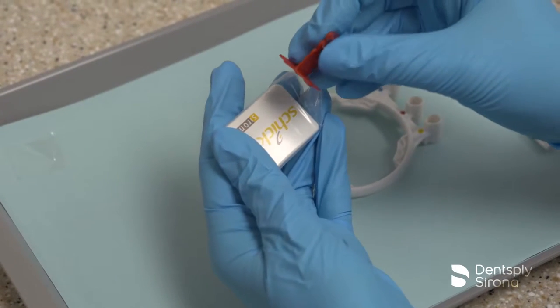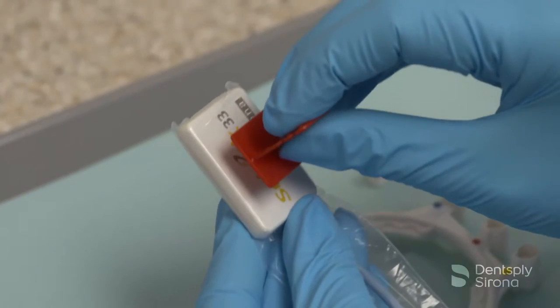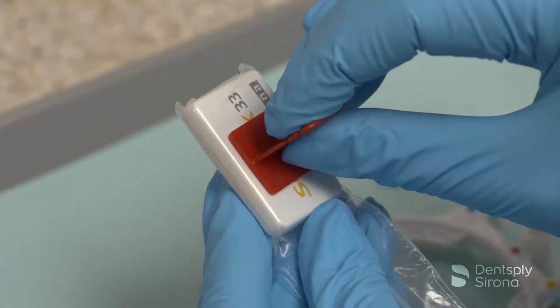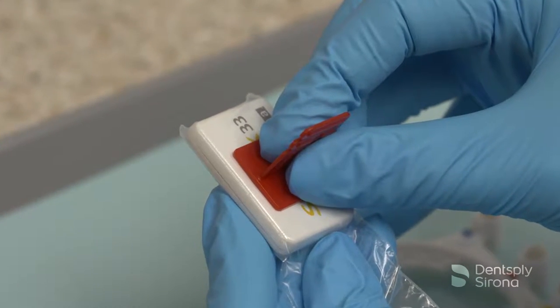Attach the fast tab holder onto the sensor cover in correct orientation for either horizontal or vertical bite wings. Press the holder firmly for five seconds to ensure a permanent bond to the sensor cover.